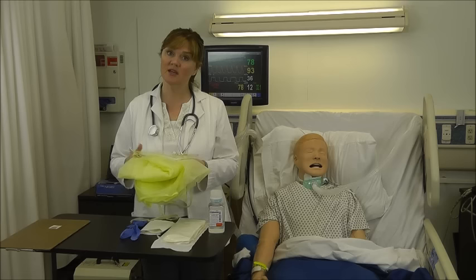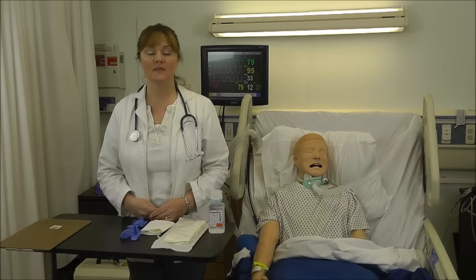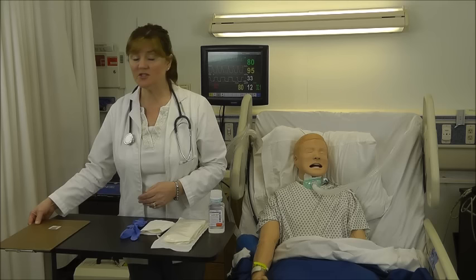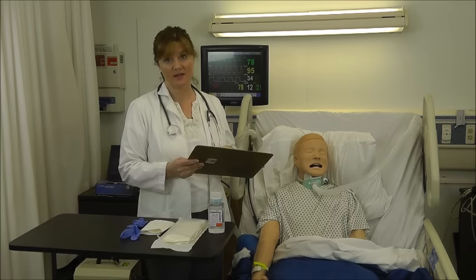Trach suction is performed every 2 hours and PRN. You do need an order to perform trach suctioning. Before beginning, I've checked to make sure that I do have an order for trach suctioning. I've washed my hands before entering the patient's room. I've also brought something from his chart that has his name, date of birth, and medical record number, because my patient's unable to speak due to the trach, and I need to be able to positively identify him.